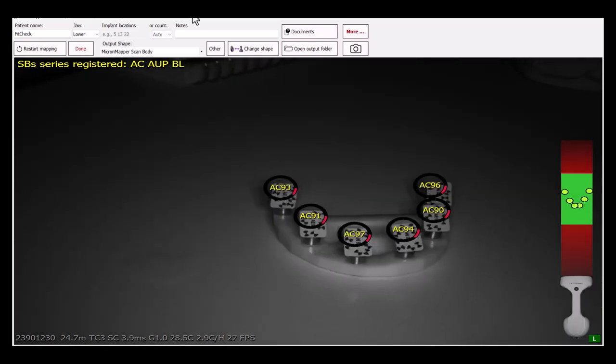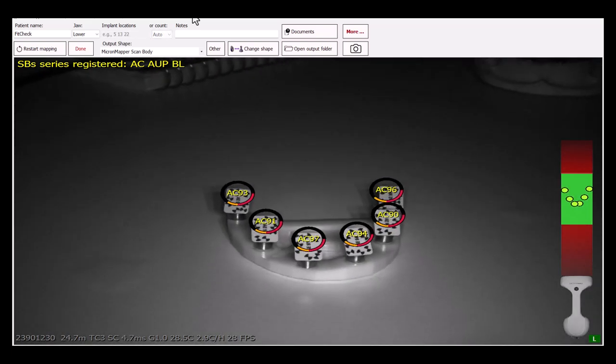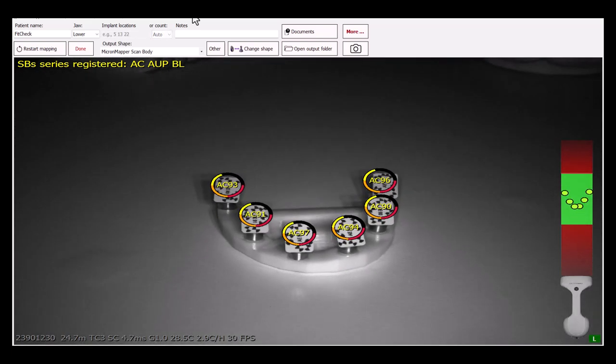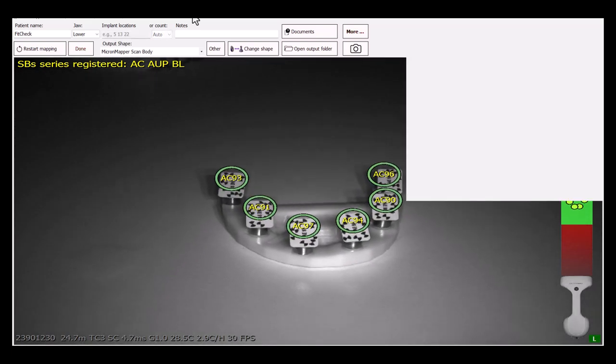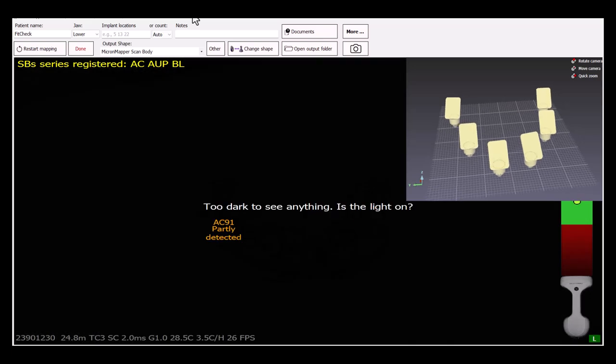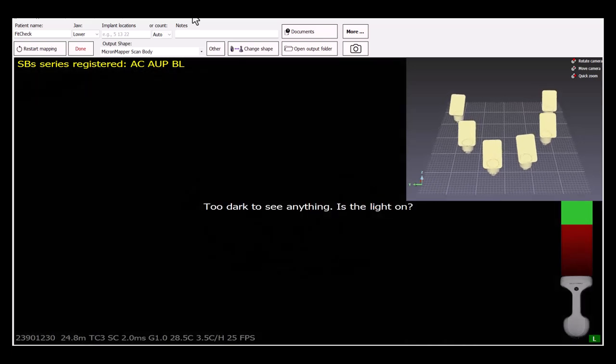Then, perform a photogrammetry scan of the prosthesis. The output file will be saved in the same directory as all of the other scans.